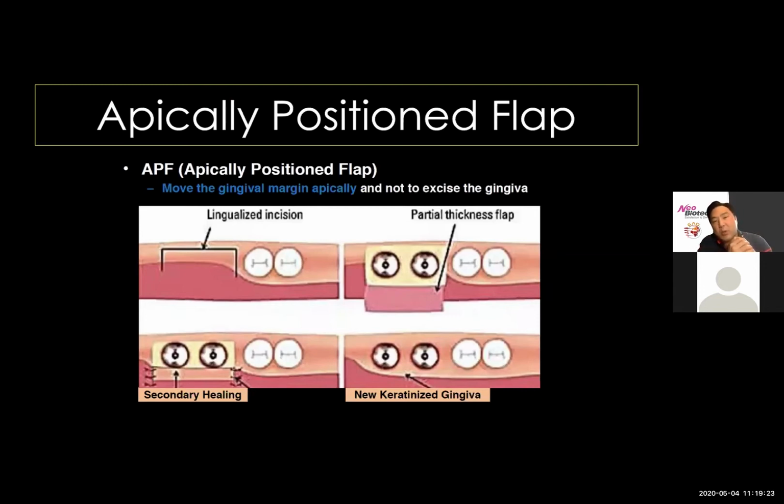That's why when we're doing our incision designs, whether I'm doing a 1-stage or 2-stage approach, I will traditionally try to make my incision more towards the lingual or palatal so I can ensure that I have a little bit more keratinized tissue when I'm doing the procedure. Hoping to do this as a 2-stage, I'll be confident that I have the amount of keratinized tissue that's going to support that implant for final restoration.